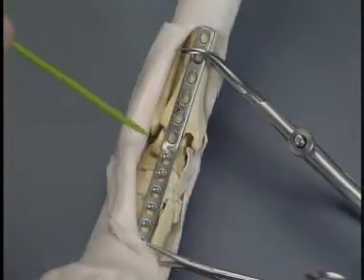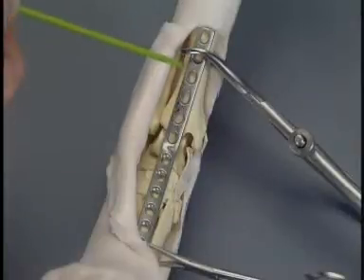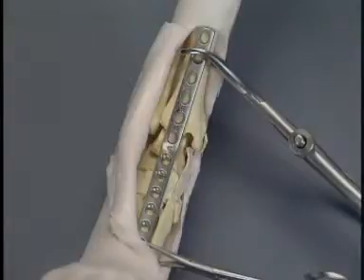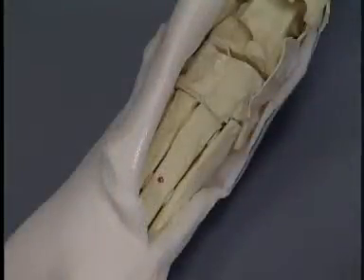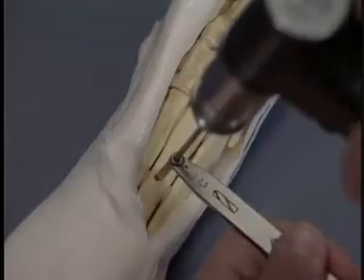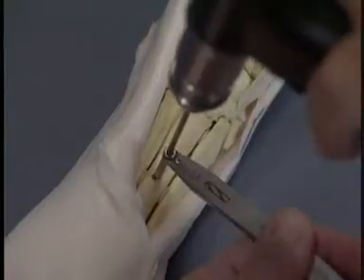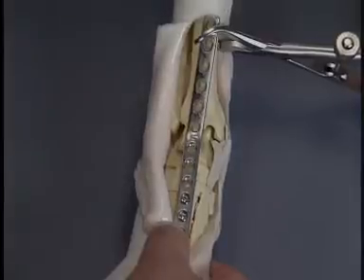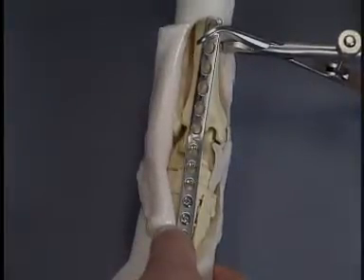There should be enough plate holes for a minimum of 5 screws in the tibia and 3 screws in the metatarsal bone. The level of the distal metatarsal plate screw is marked. The plate is removed, and the drill is centered on the metatarsal bone to prepare the first screw hole. The plate is secured with 3 screws in the metatarsal bone.